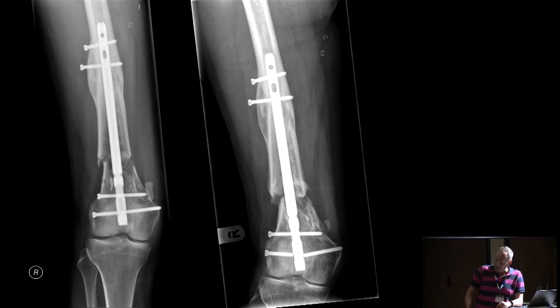Yeah, so you can see the fixation has failed. There's gross loss of position of this fragment, tilting the fragment into valgus. And this is where she was left. So she was referred to me at this point.